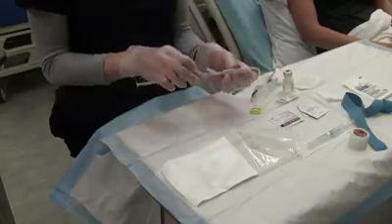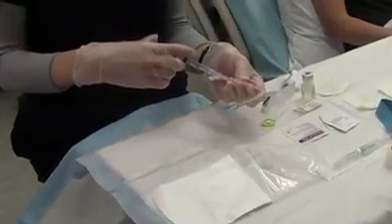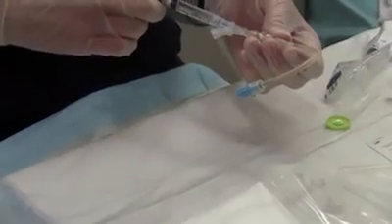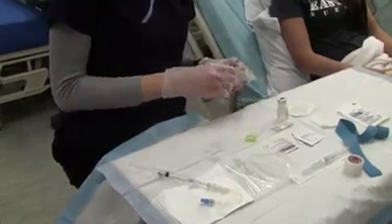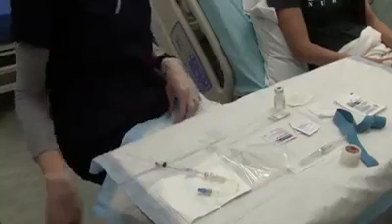to the IV extension set or saline lock. Prepare your patient. Assist your patient to a comfortable position. Place a towel or a bed protector, such as the chucks, under the extremity to protect the linens.